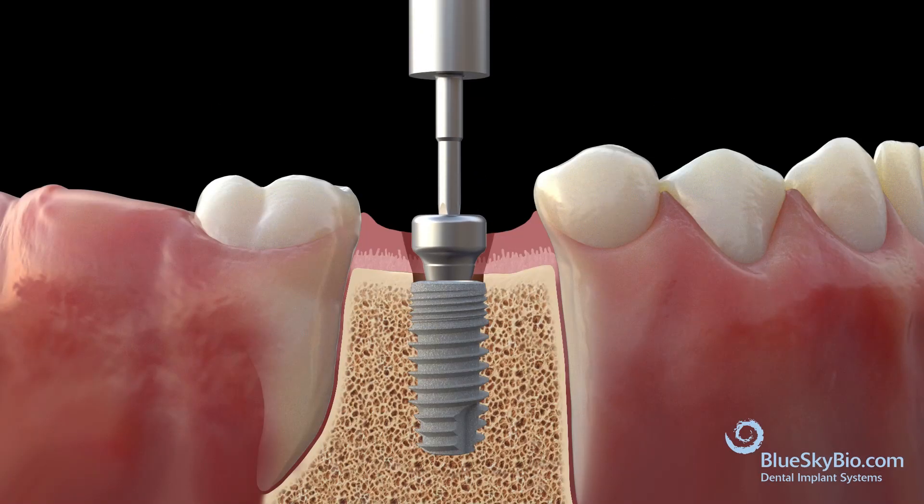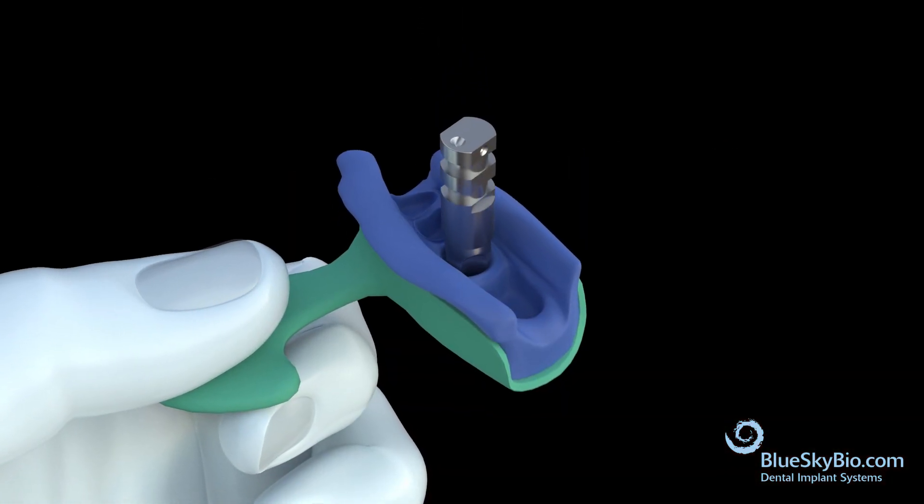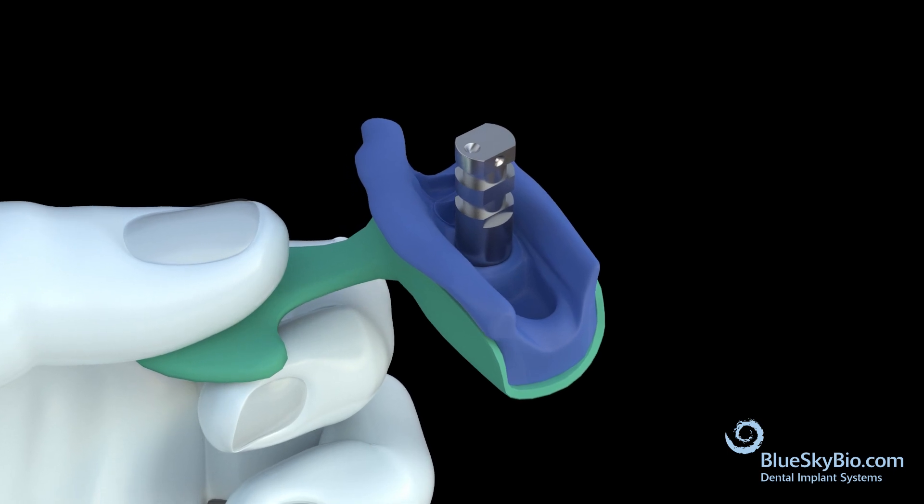Place the healing abutment back onto the implant. Make sure the combo is perfectly positioned on the impression by placing it until no movement is felt.